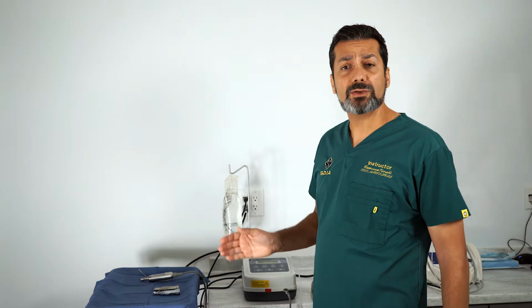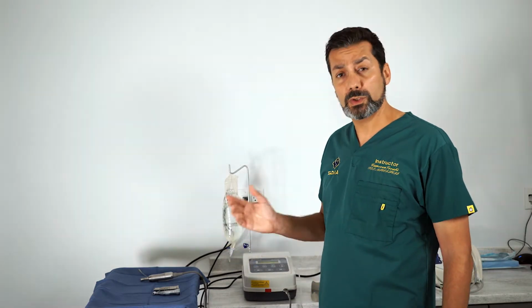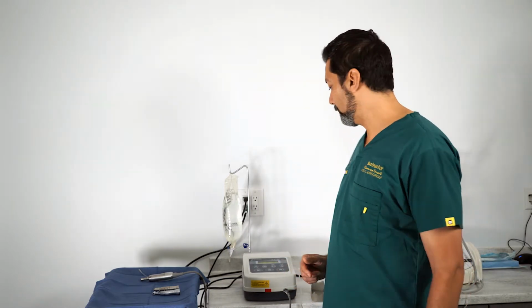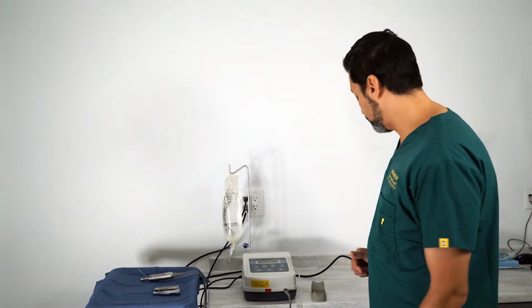There are also contra-angles that are 1:1. There are 45-degree surgical angles that are 1:1. There are many different options out there, but these are generally what's used the most. Now let's talk about the different programs and how you can set it.